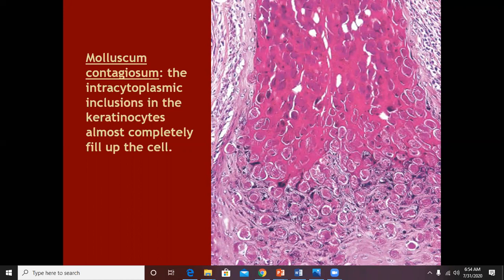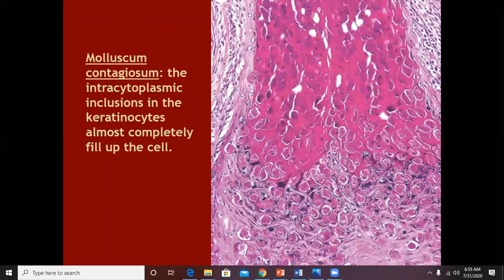Then for ORF, there are intracytoplasmic inclusions. And for molluscum contagiosum, there are very prominent intracytoplasmic inclusions that have pushed the nucleus to one side. So some infections are intranuclear and some are intracytoplasmic.